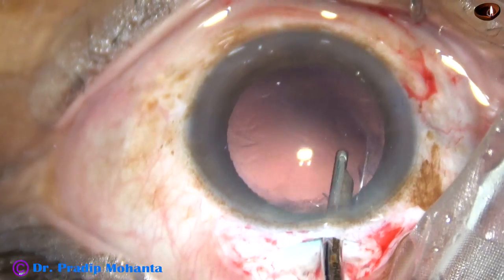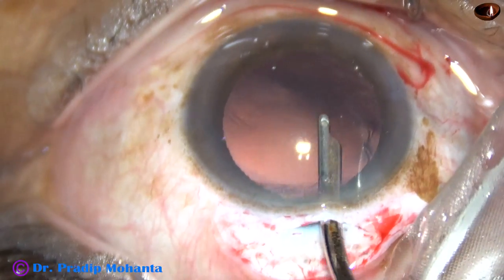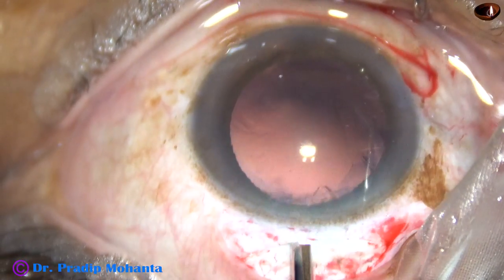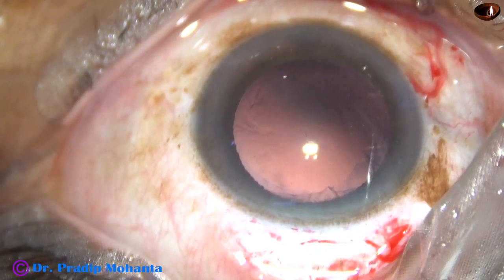This is polishing of the posterior capsule with the help of the Simcoe cannula. This is a 23-gauge Simcoe; we can also use a 22-gauge or 20-gauge Simcoe cannula in small incision cataract surgeries.